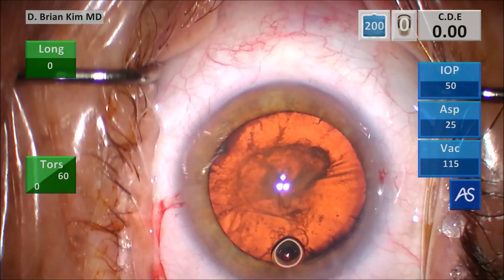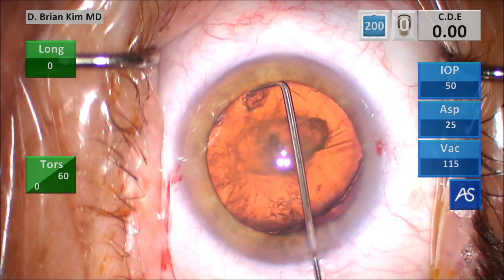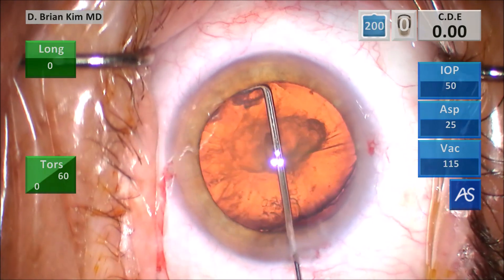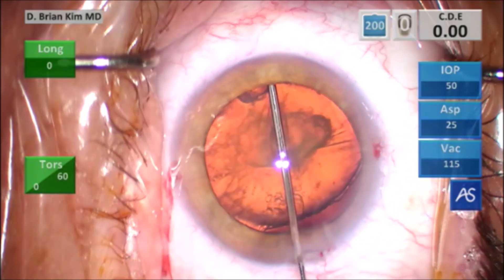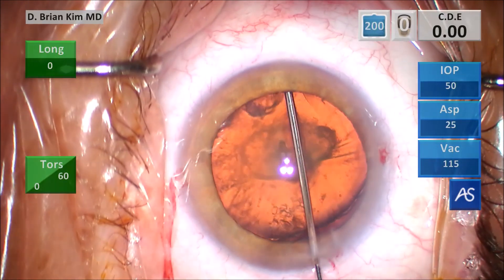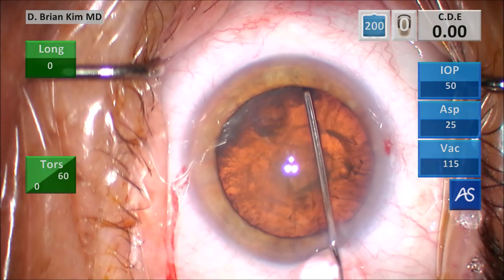This is the capsule fornix hydrodissection technique. I'm trying to get under the rhexis edge and look what happens — I'm very gentle. I always slide very gently under the rhexis edge, but because there's not a lot of zonular counterforce, it creates this area of stretch as I'm trying to slide that cannula under the rhexis edge. You're seeing the stretch of the zonules, which is again another indication that there's some zonular weakness.